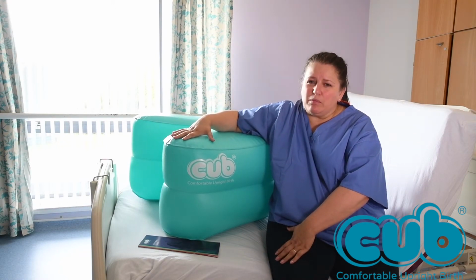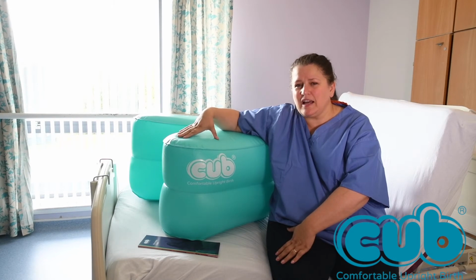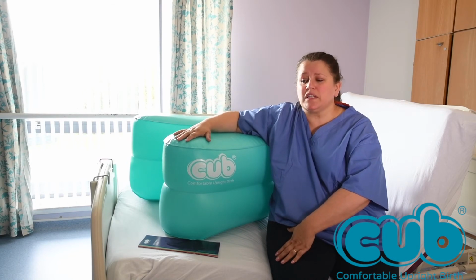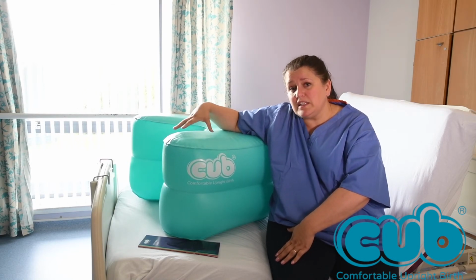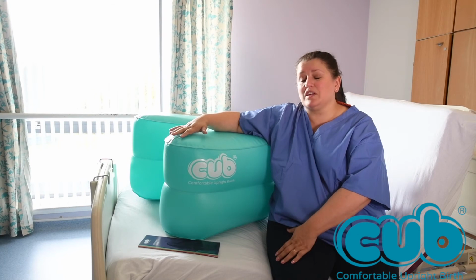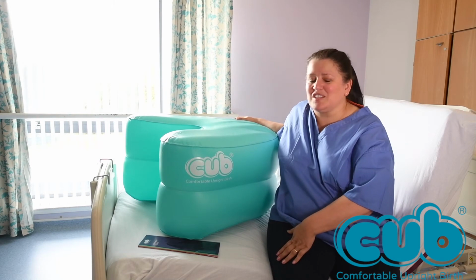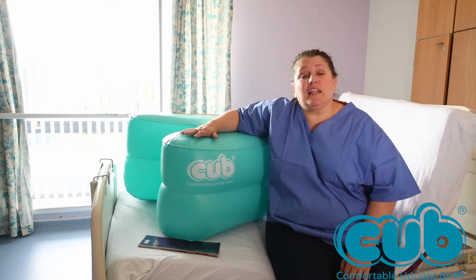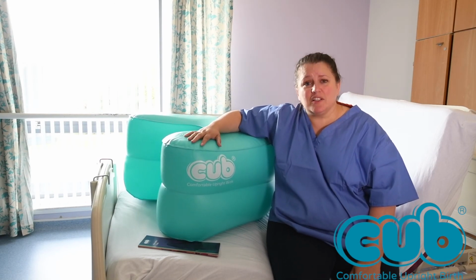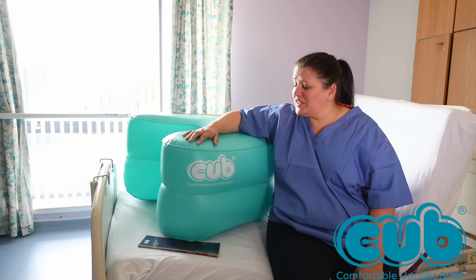The other thing to think about with it is the weight limit of this product is 120 kilos, which is about 19.5 stone. So if you have somebody who is bigger than that, then we don't recommend that they use this product. Equally, we need to make sure that people understand it's not to be used by two people at one time either. So somebody sitting on the front and somebody else squeezing themselves on the back is just a big no-no. Don't allow your colleagues or yourself to play with it, kick it around the floor. Don't allow visitors or their children to play with it and move it about anywhere either.